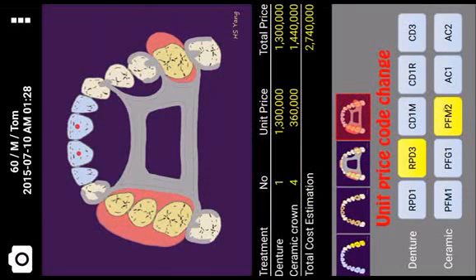If you select a different price code, the estimated total cost will be changed.